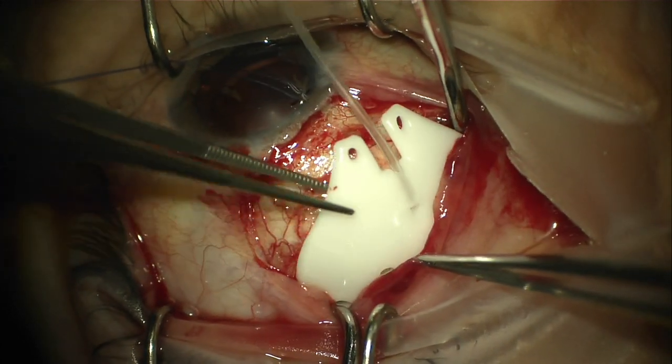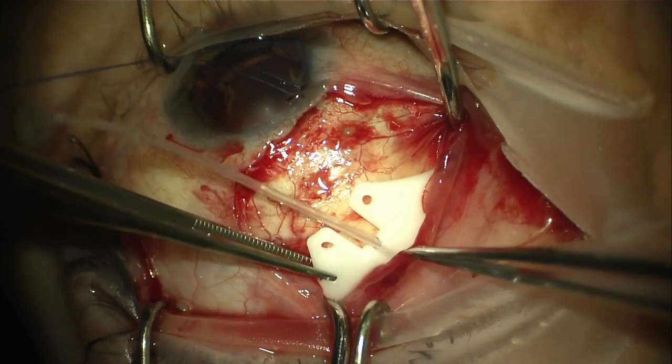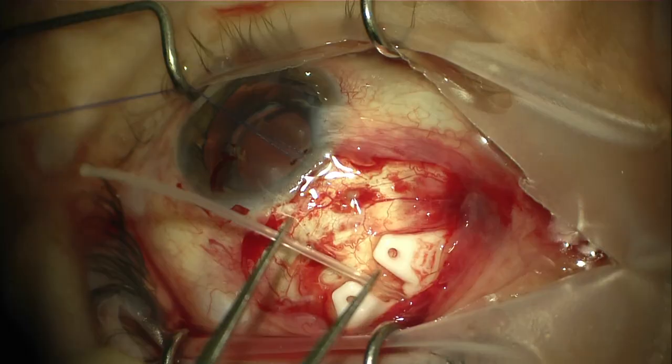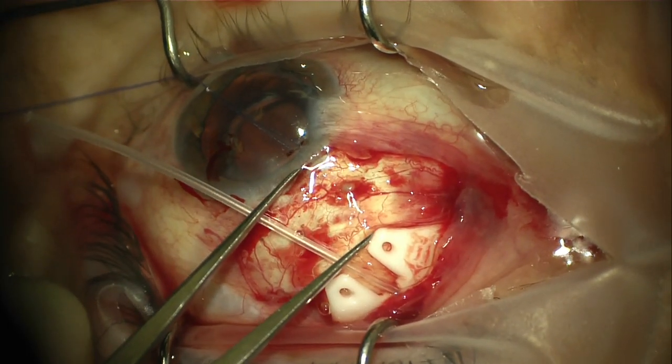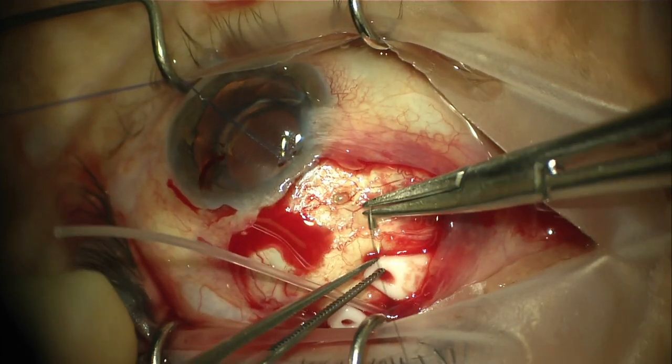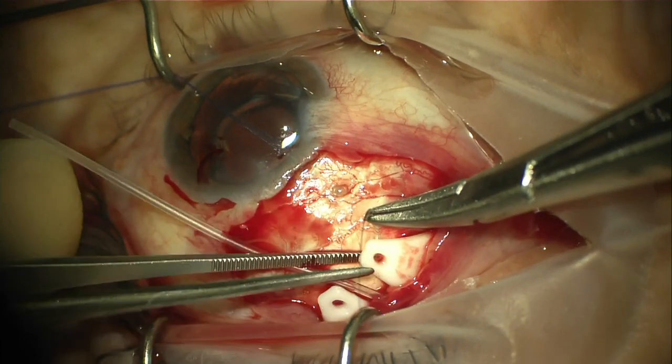You can see the ease with which it is implanted between the muscles. In this case we are using muscle hooks, however it is not required for implantation. The anterior portion of the tube should be fixated approximately 6-8mm posterior from the limbus, a little more anterior than your traditional tube shunt.